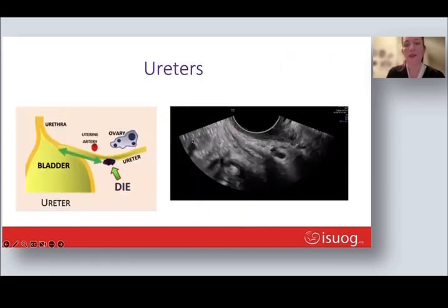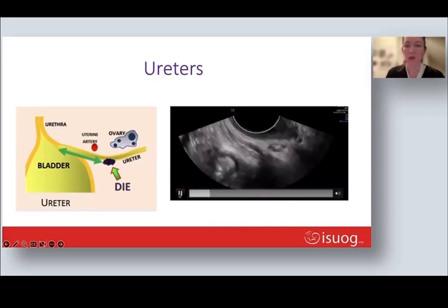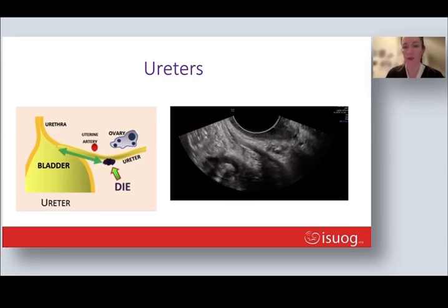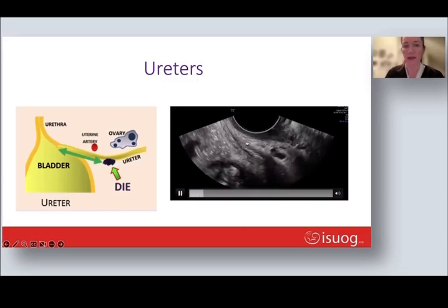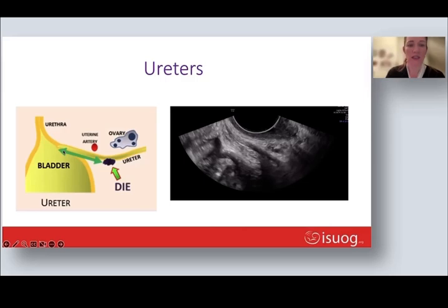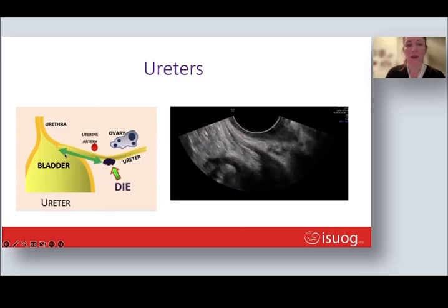While assessing ureters and ureteric endometriosis, it is important to be able to identify the ureters. Here you see an image of a normal ureter with a typical contraction. In case of endometriosis lesions in the ureters, these lesions are usually situated further away from the ureter opening into the urinary bladder.